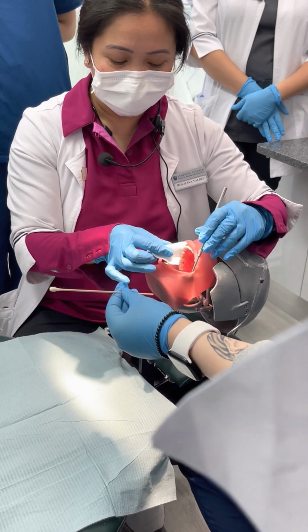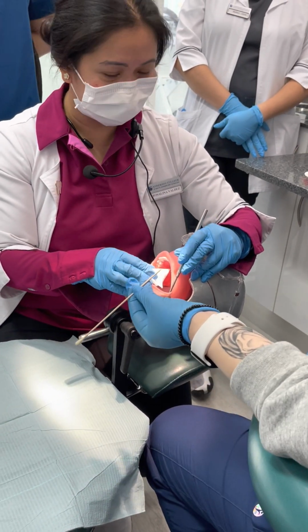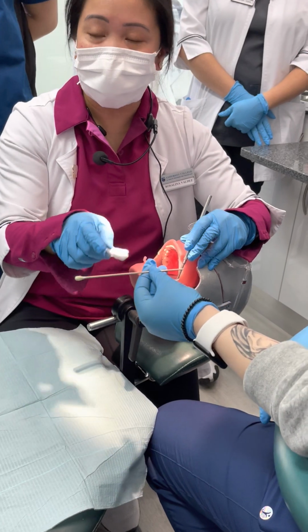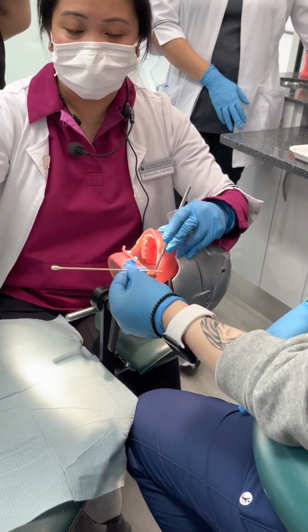To wet the area. To keep it dry. Yeah, to keep it dry. You have to make sure it's dry now because I have to apply the anesthetic gel. I said the mouth is here, not there.